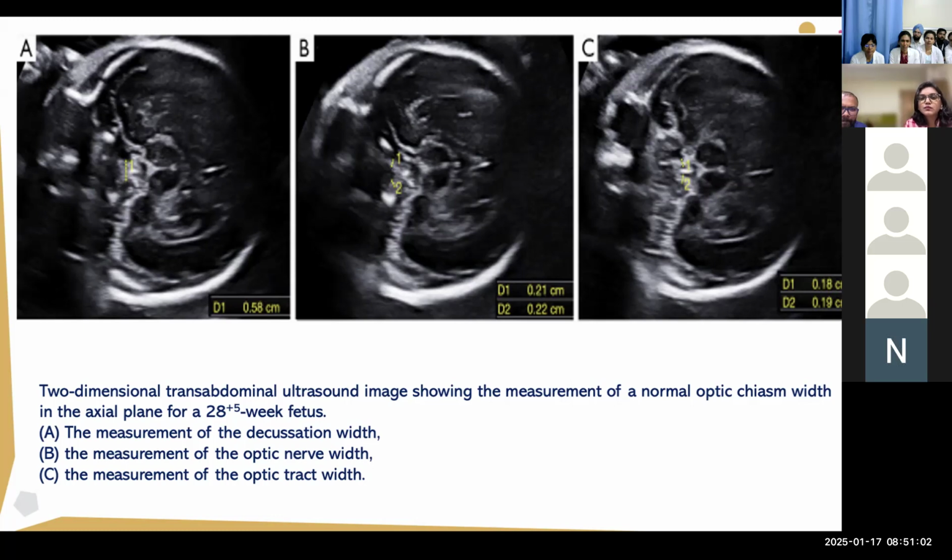Maybe, sir, the optic tract is something which continues into the temporal lobe. So it's a very small tract in the system, and you may not be able to see it on the ultrasound. Yeah, so thank you, Major. They seem to have shown something here. Maybe you can combine this in your journal club, and we'll see whether they claim it is reproducible or they say at the end, this is what we think, but we are not sure. We have to see that also.